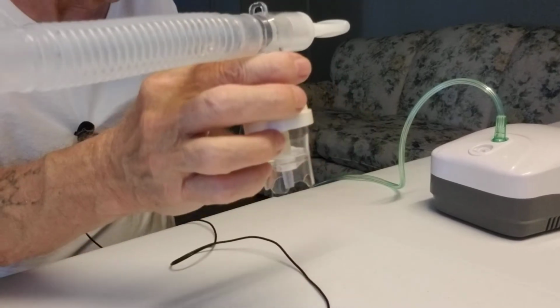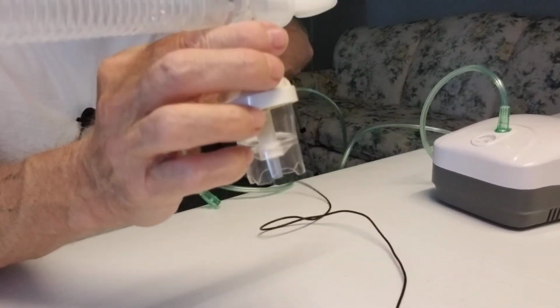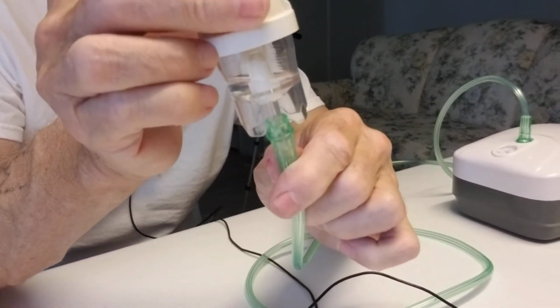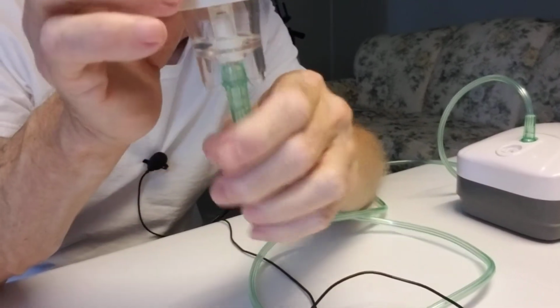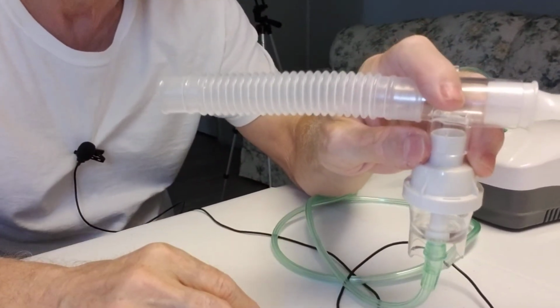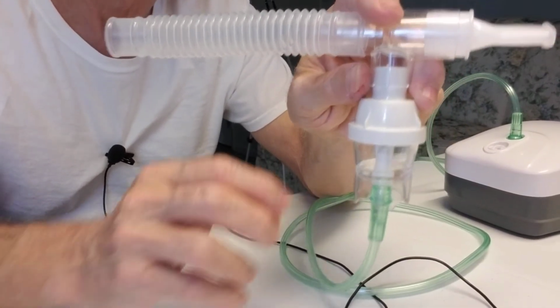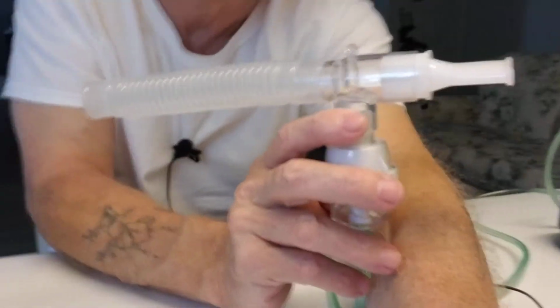At that point, you can take your hose and you will attach it to the bottom. Slide it on securely, and there you go. That is the simplest way that I can explain to you how easy one of these is to put together. Now, I'm going to give you a demonstration of how this works.